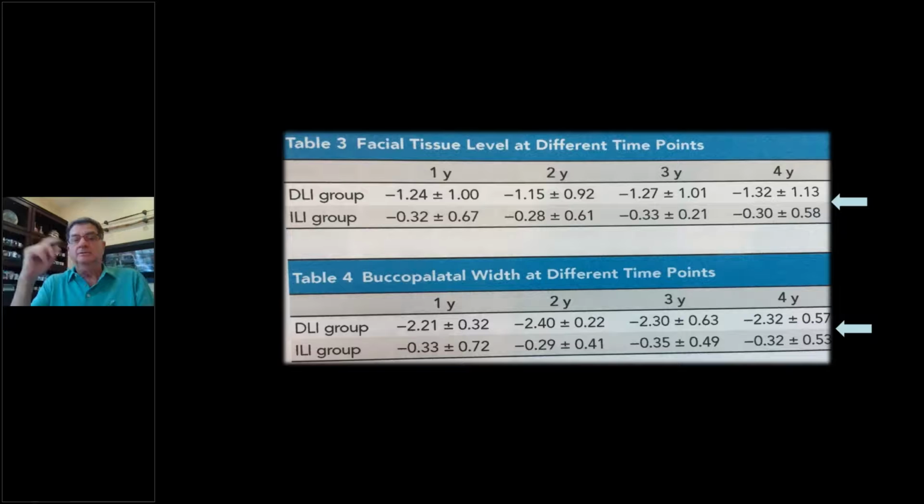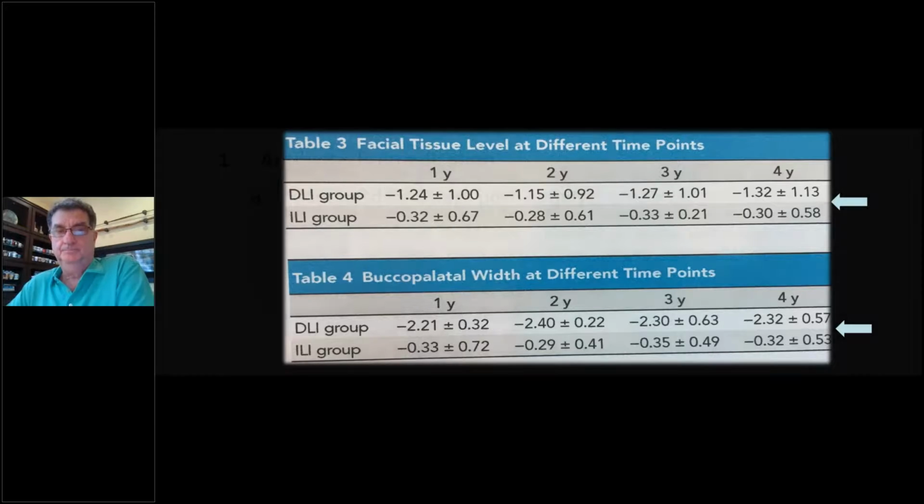So this is why an investment of a few extra minutes, 10 extra minutes, you put some flowable composite in around the eye shell, round off the bottom, and then screw it in. It keeps the tissue open for you to let it heal around it. Makes a big difference, even if you're not going to put a full temporary on.